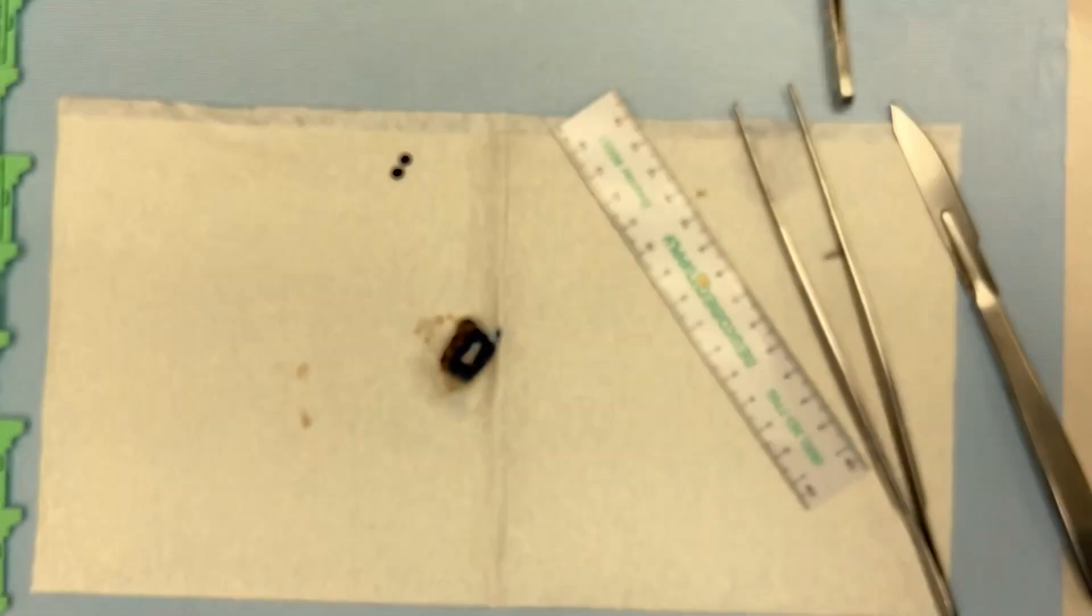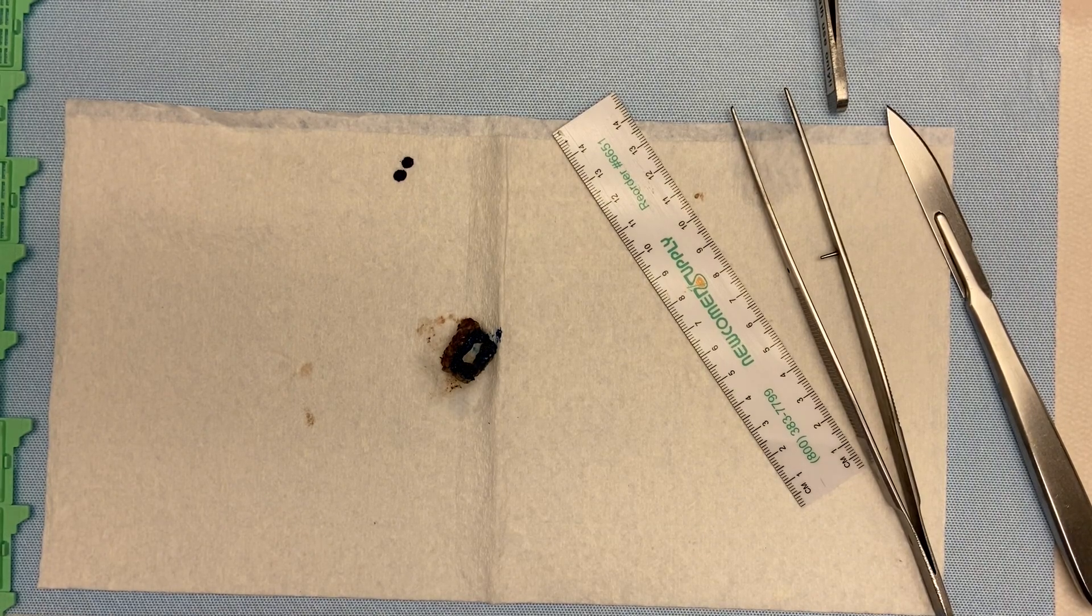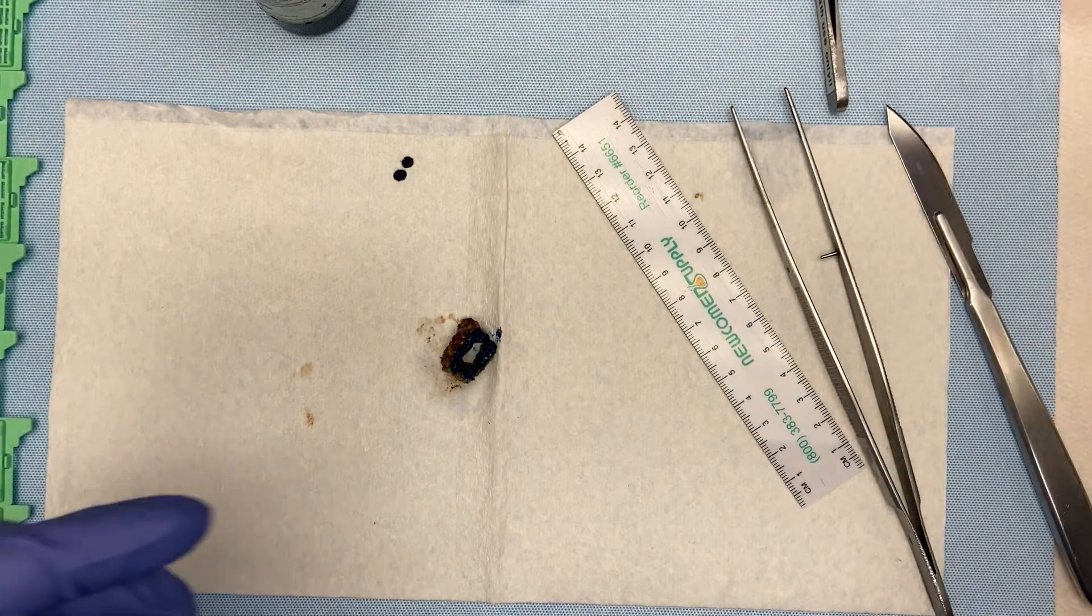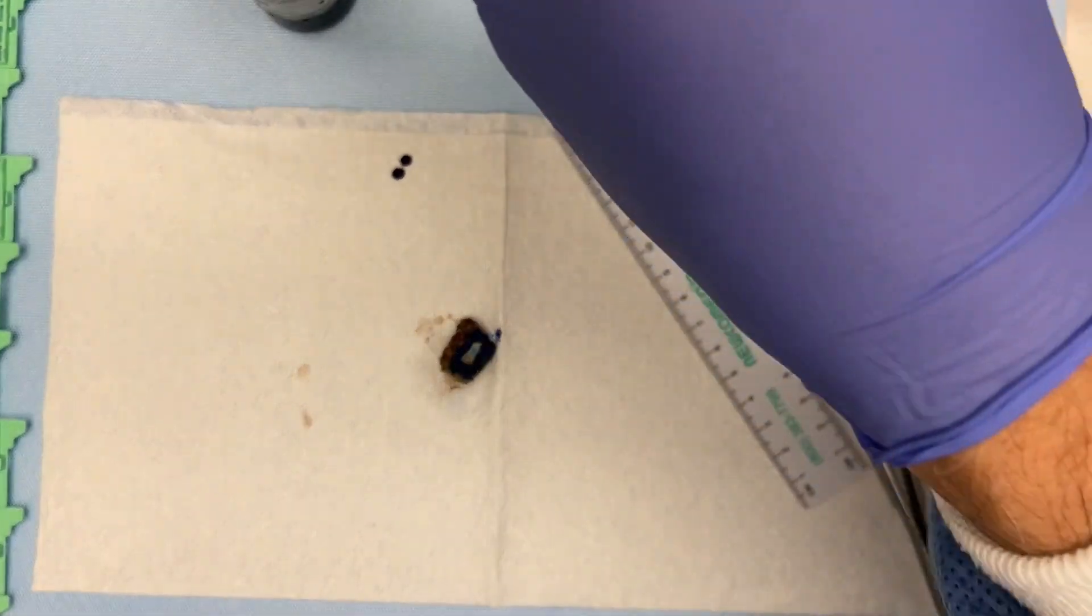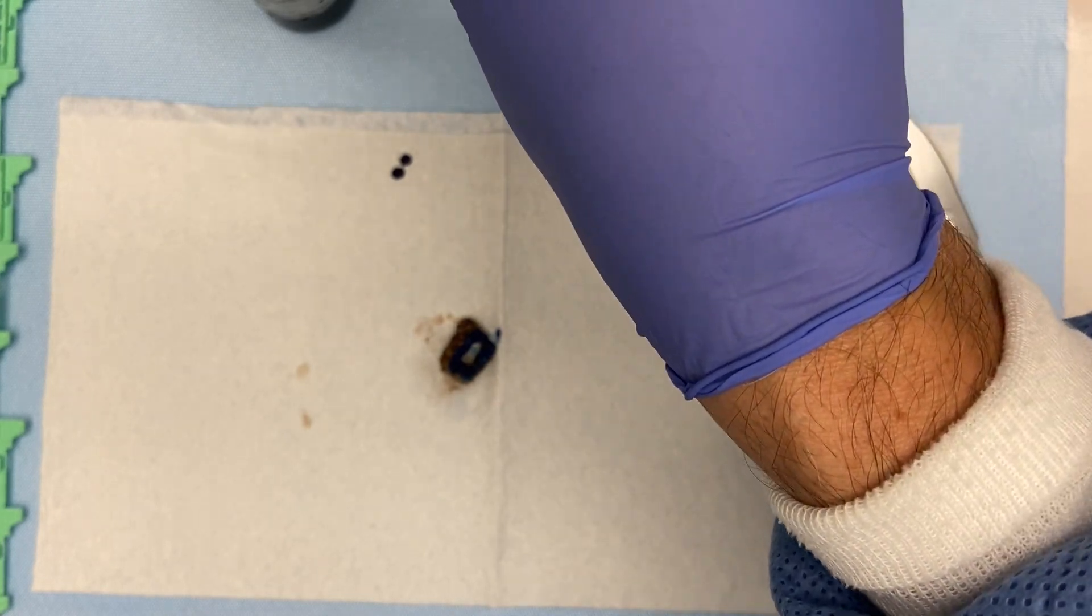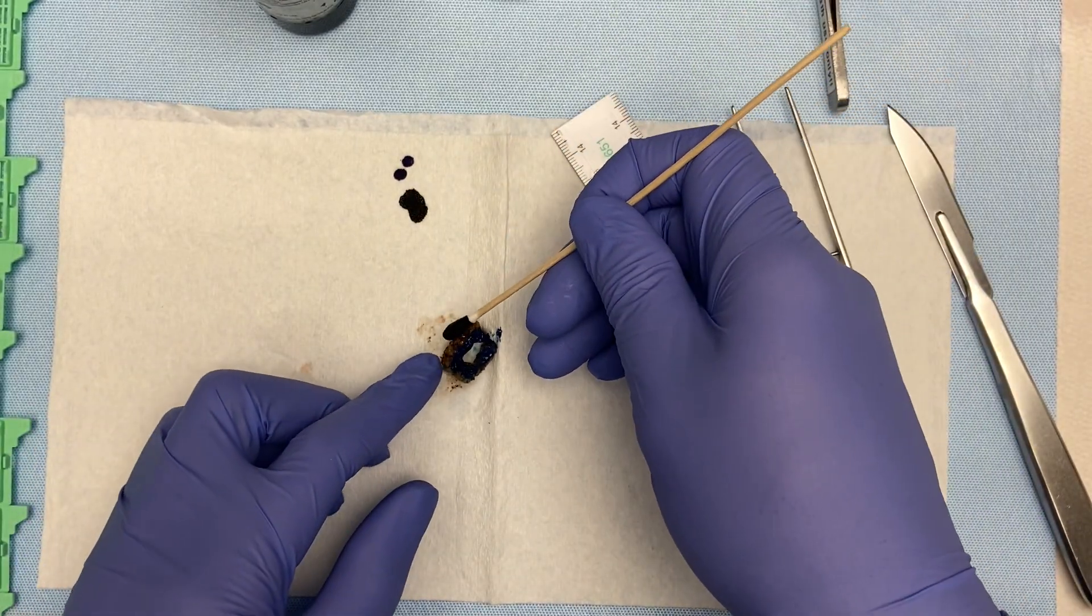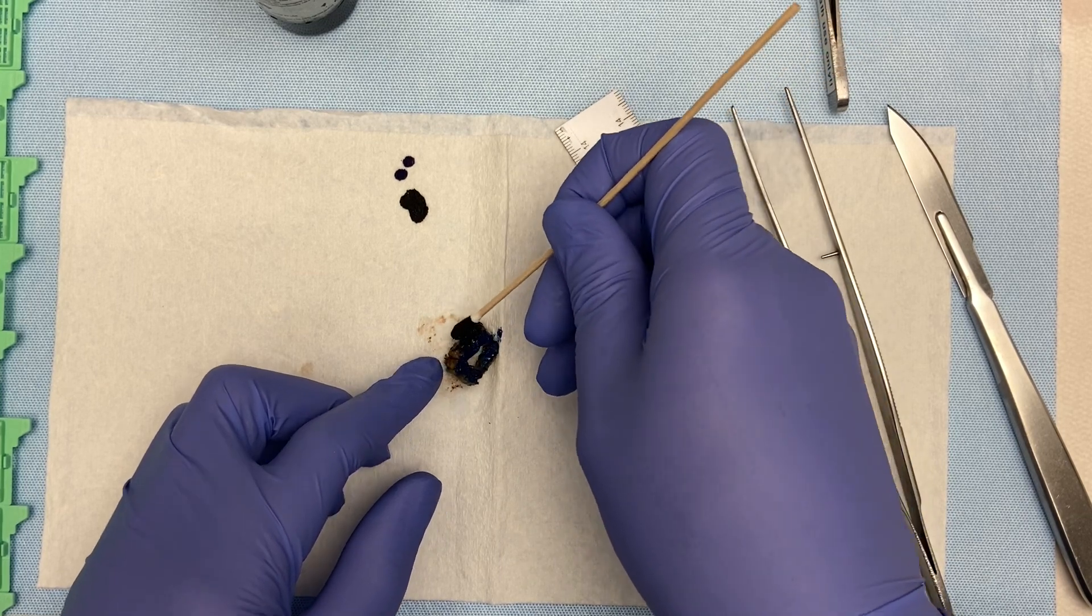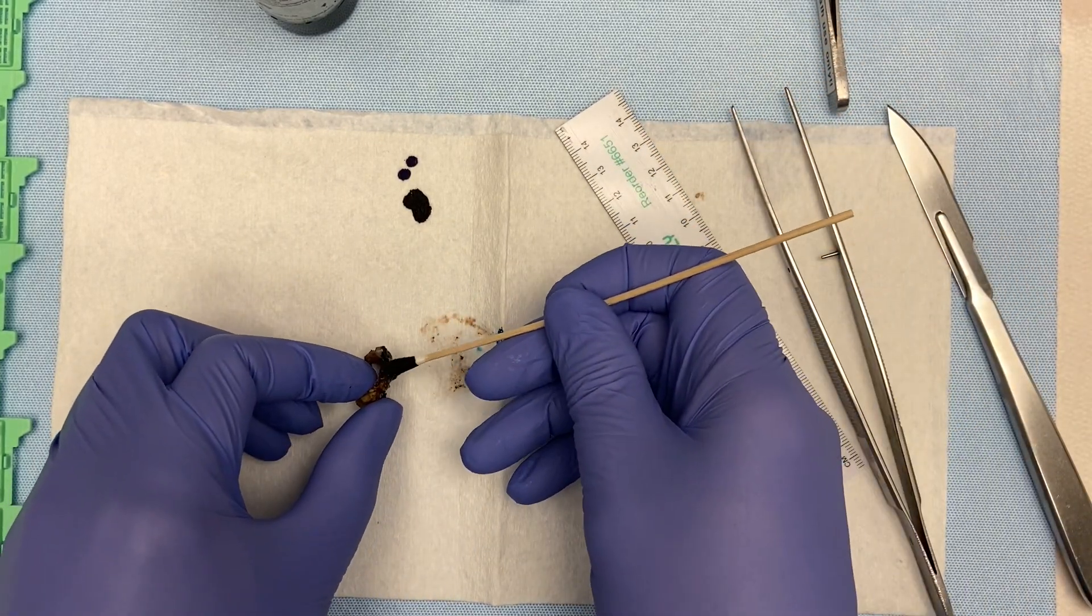Not every LEEP you'll be able to do that. Some of these things come in pieces. Some of them are thick and thin in areas. This thing is pretty symmetrical all the way around, so that's mainly why I decided to do a video of this. This is a good, perfect example of what a LEEP should look like.